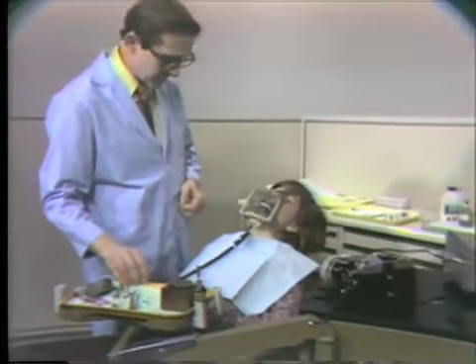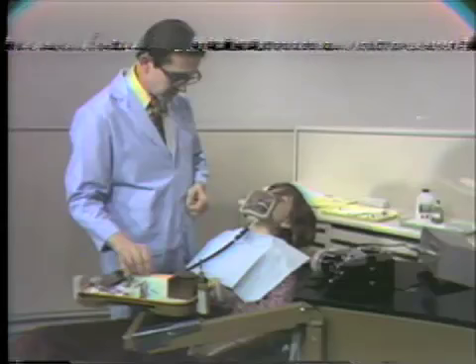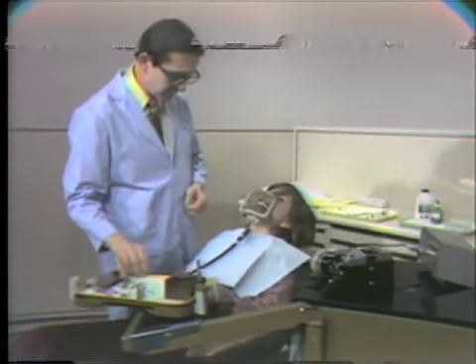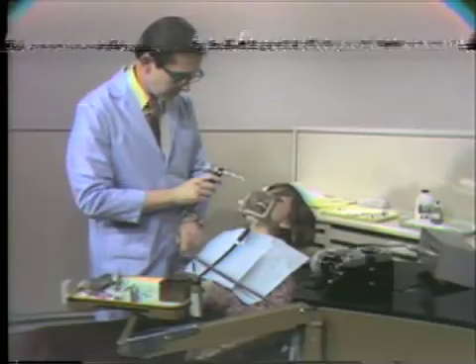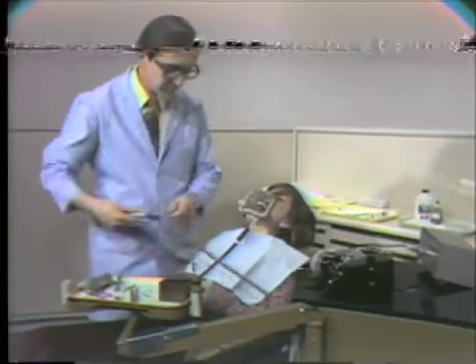Carolyn, I'm going to apply some agent to your teeth that might cause a burning sensation if it seeps up under the rubber dam and up against the gum. If the gum starts to burn at all, if it's very uncomfortable, you make some noise and try to point to that. And if the gum is burned, what I'll do is get out our suction and our water here and wash everything down real quickly. And some of that burning sensation should stop.